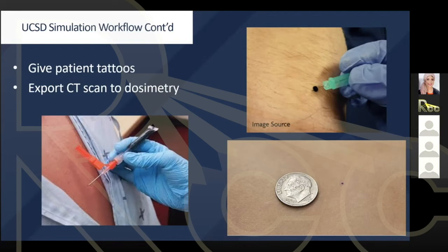We will not tattoo again. Tattoos are difficult in Black patients. Also, it's painful. Does the patient feel hurt from tattooing? No, it's not that hurtful. Just smile and say you will feel just a little bit of a kick and that's it.